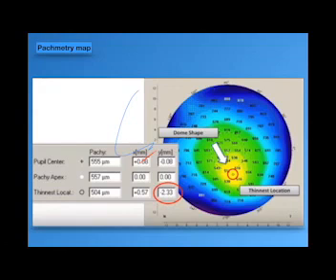The vertical deviation is more important than the horizontal deviation, because the behavior of the corneas is inferior, especially inferonasal, in keratoconus. So the inferior or vertical deviation is more important to consider than the horizontal or superior deviation.